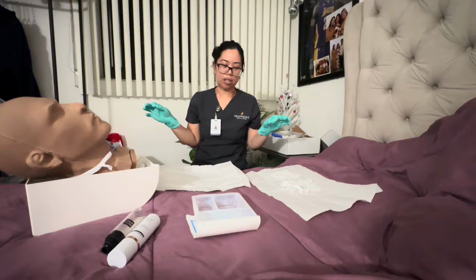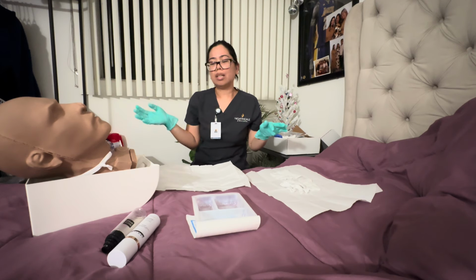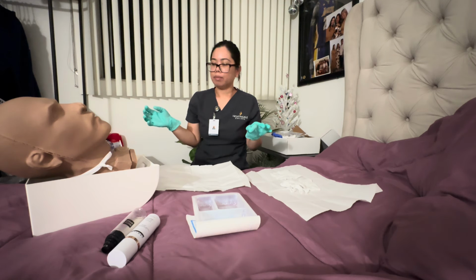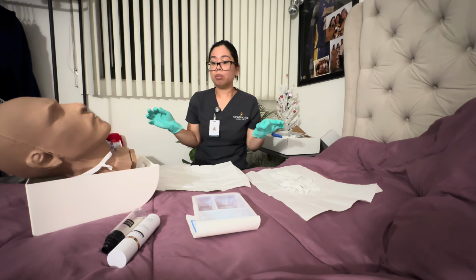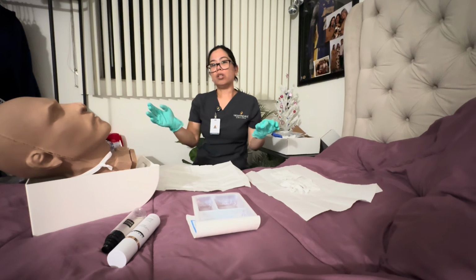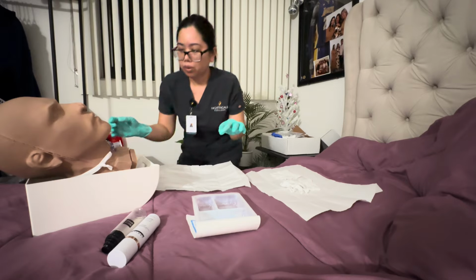Okay, so now that we cleaned the area, what we're going to do next is change the tie of the tracheostomy. In order to change this, I would need to ask for assistance. One person is going to be holding and stabilizing the tracheostomy while the ties are being changed. For today's purposes, we don't have an assistant, so we're just gonna do it on our own.